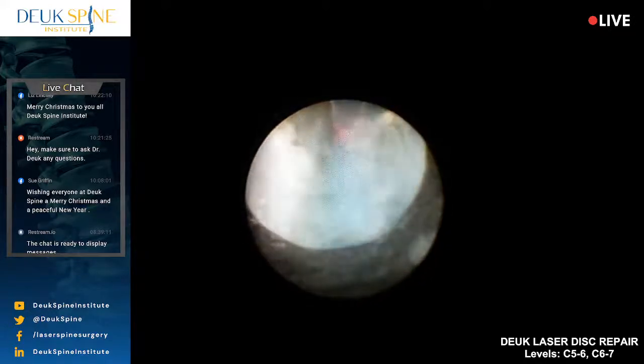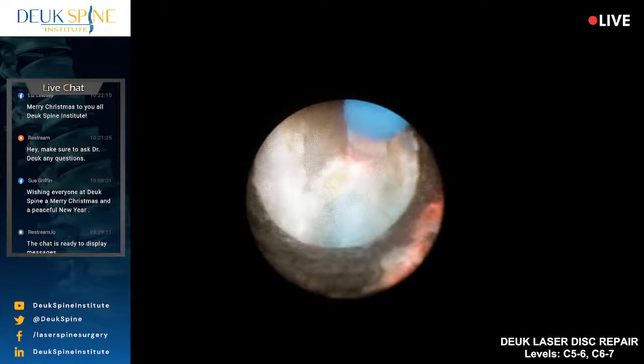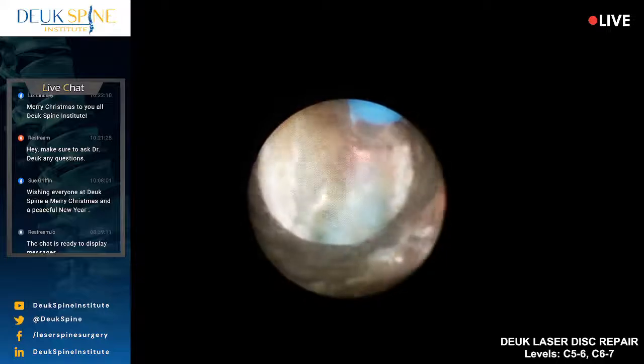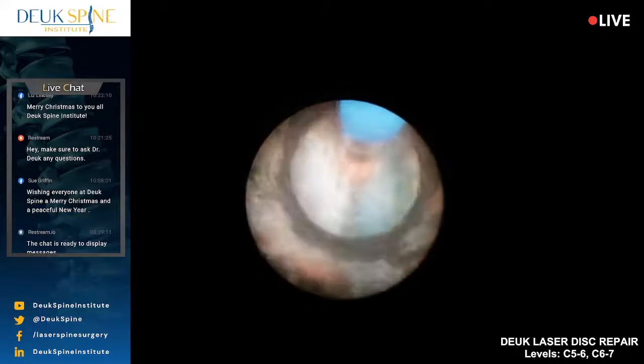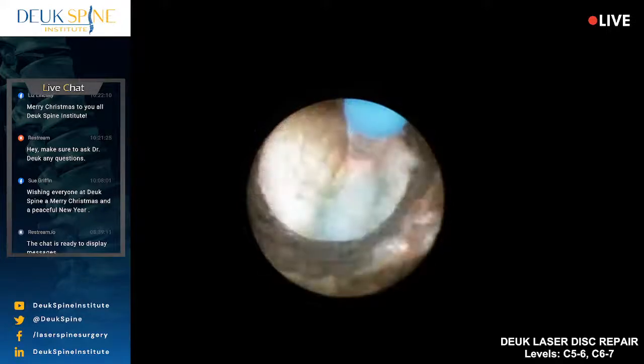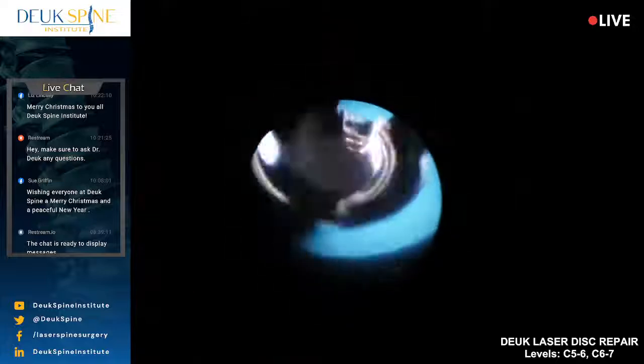I can't tell. That looks like a little bit of disc material there, and I want to get rid of that and just make sure the nerve is well decompressed. It's a little osteophyte underneath. I'm pretty happy with that. I think he's going to be happy with that too. We're done here. Lights on, please.